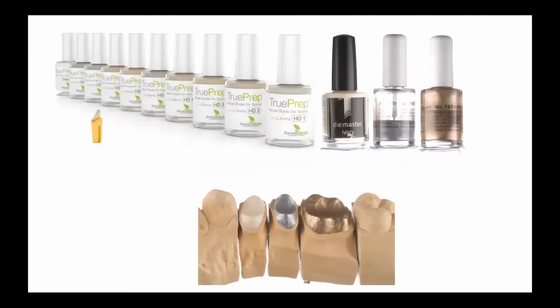And the other way to imitate the shade of the prepared tooth is the line of natural die spacers. We have a selection of different die spacers, and we can apply them on the die, and this way this die will imitate the appropriate shade of the prepared tooth. And we can use, for example, the silver or gold die spacer to imitate the metal post of the appropriate material.